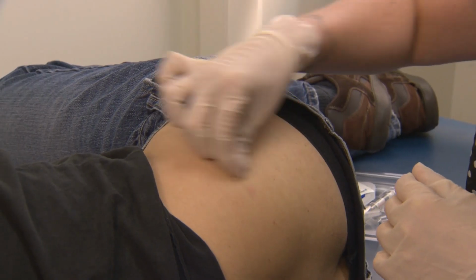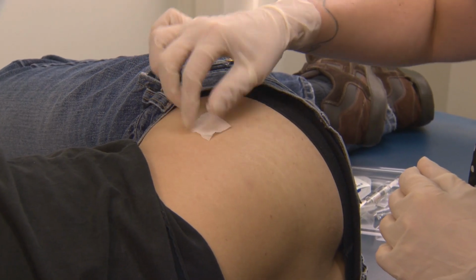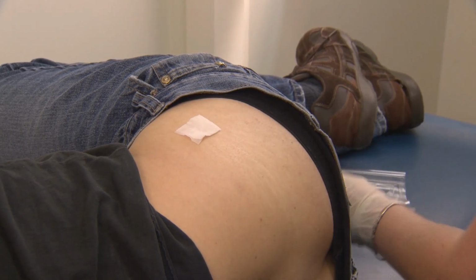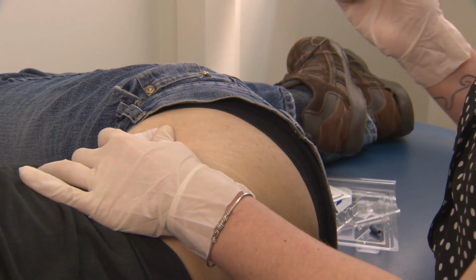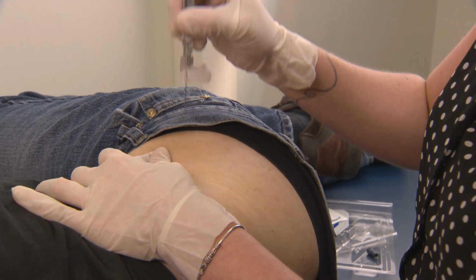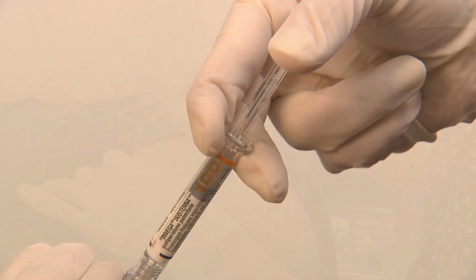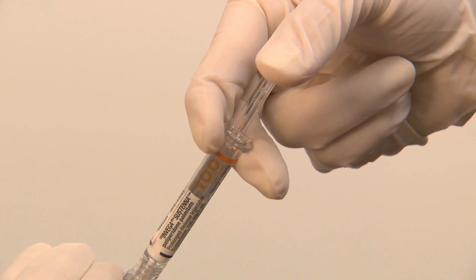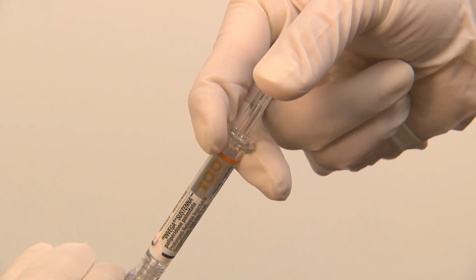In order to make use of the Z-track technique, the nurse should use their non-dominant hand to pull the skin and subcutaneous tissue 1 to 1.5 inches to one side of the injection site prior to injecting. This creates a disjoint perforation or broken injected pathway that locks the medication into the target muscle, preventing flowback.